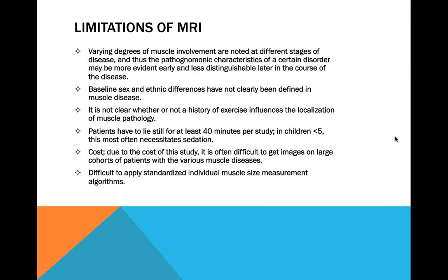The reason is because even if you were to make a standard template, the standard template kind of shifts between patients, and also you'll notice if there's atrophy of the muscle or if the muscle shrinks at all, it'll actually shift position, so it won't actually be in the same exact place.